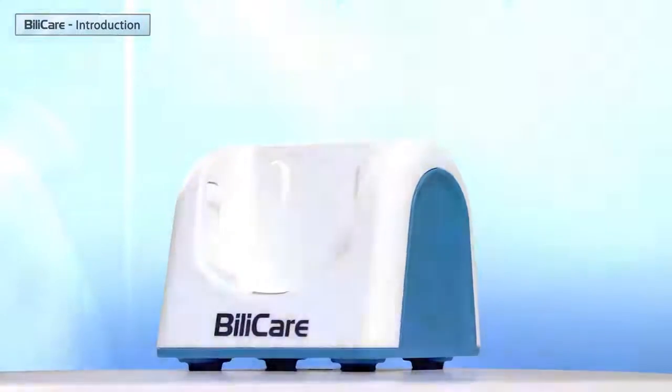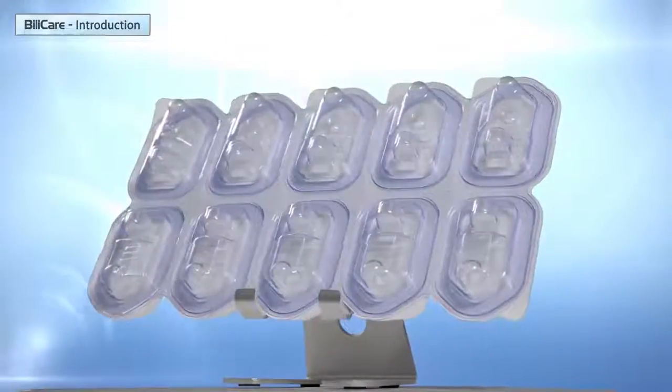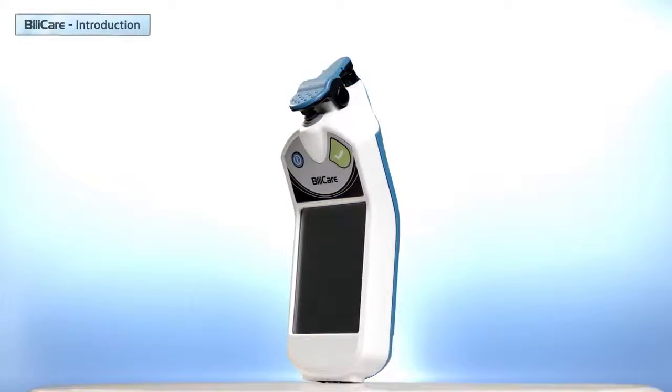The Bilicare system contains the following parts: charging stand, power supply, optional covers, calibration check tips, and the Bilicare handheld device.